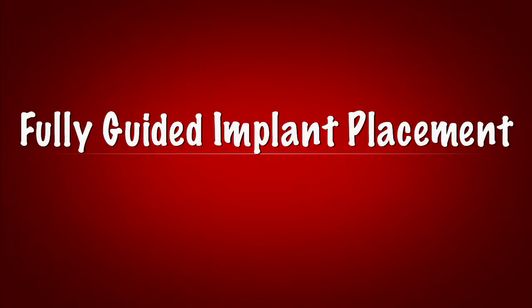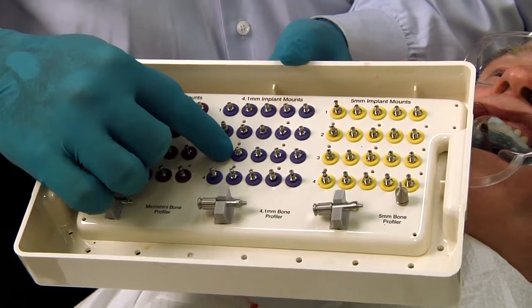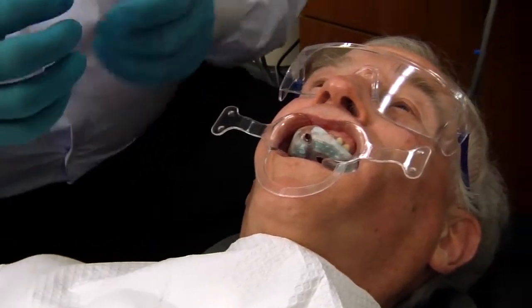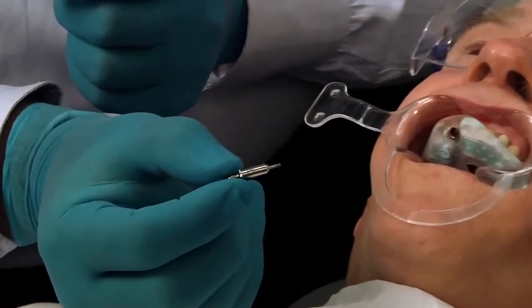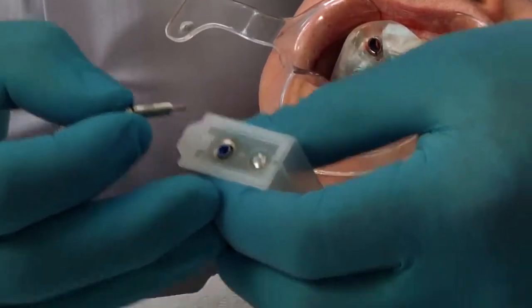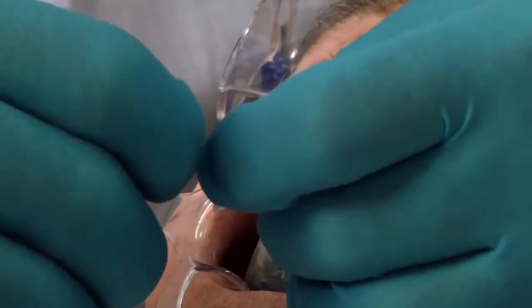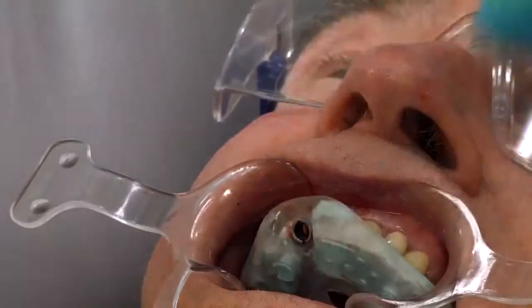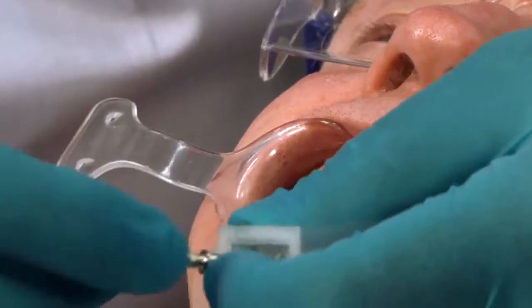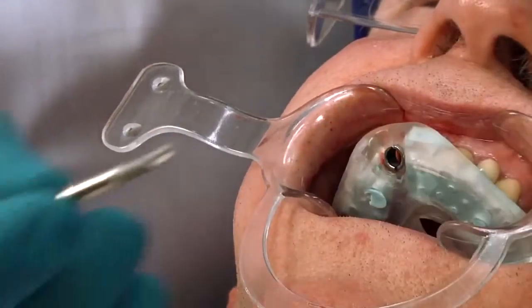If you look on the surgical plan, there should be what's called an implant mount. So what I do is go to my four millimeter implants and mount number three. This is the mount that's specific to this particular case — implant mount four, three. What I do then is, while over the patient, we put that mount onto the implant and then we'll affix it and screw it in to the implant, just like so.